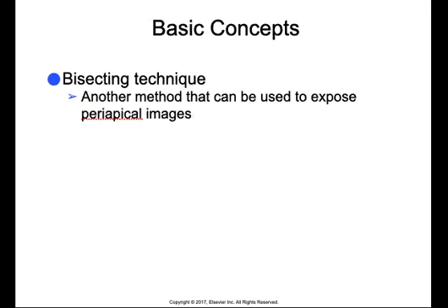All right, some basic concepts. The bisecting technique is just another method that can be used to expose PA images. The bisecting technique is also known as the bisecting angle technique or bisection of the angle technique.